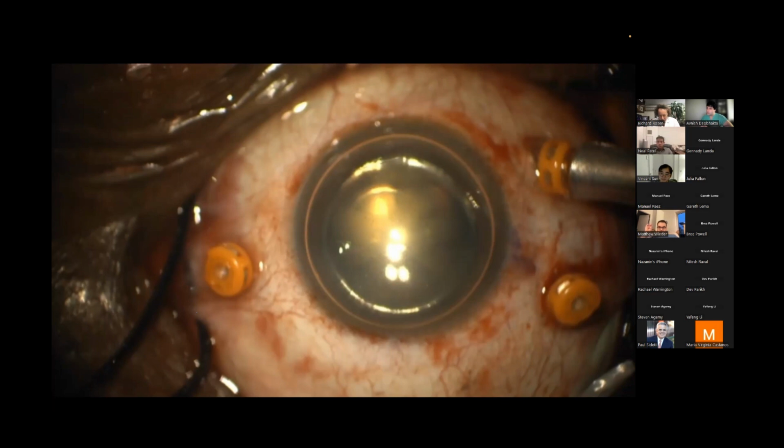So sometimes you get not a great view, especially with pseudophakic lenses, and then suddenly, oh, it's so clear now. Then you go back and refocus, and you see, oh, there is a bubble in the AC. So sometimes it's helpful because it prevents fogging. But in this case, as Neal was saying, unfortunately the anterior capsule of the lens was pushed by the bubble, and it makes the red reflex difficult to look at.